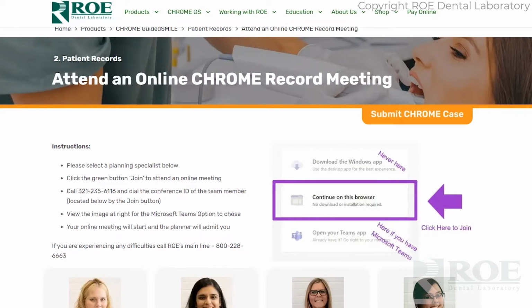So what we ask is that you schedule an appointment. When you know a patient's coming in for Chrome records, schedule an appointment. You'll simply click on, for instance, join Brittany, and that will allow you to join an instant meeting. Turn your camera on. We'll turn our iPad on or our computer, and we'll see exactly what you're seeing.